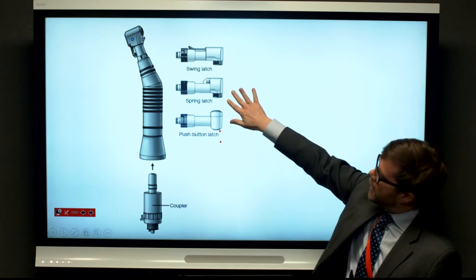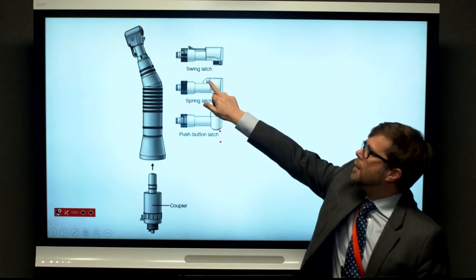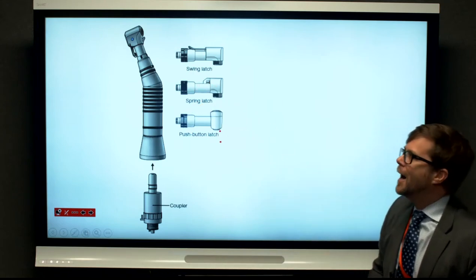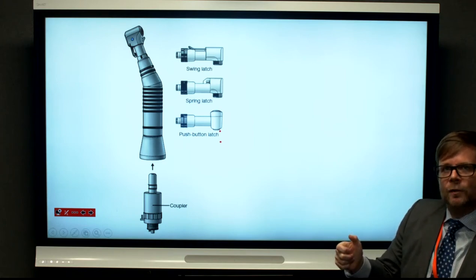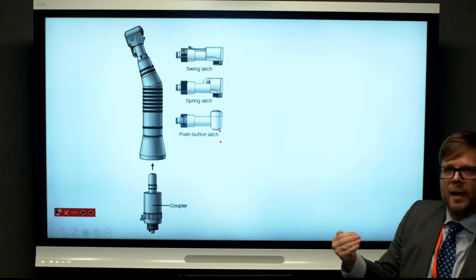There's also a spring latch where you push against the spring latch. It will allow you then to place the burr in the chuck, and then you release the pressure from the spring latch and it will spring back and lock.